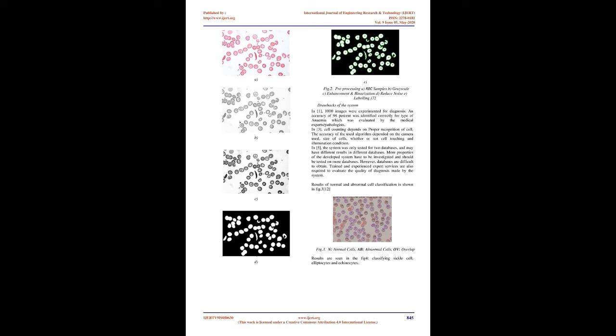After pre-processing, filters are used to remove the noise from the image as to get a better image. Here, for noise removal they have used median filtering. Then is the segmentation of image. The sickle cell affected blood smear image consists of normal RBCs, abnormal RBCs, sickled RBCs etc. The main problem of sickle-celled RBCs is that they cling together and block the blood vessels. Otsu's method and watershed segmentation method are used for segmentation purpose. Watershed segmentation gives better segmentation result in segmentation 5.